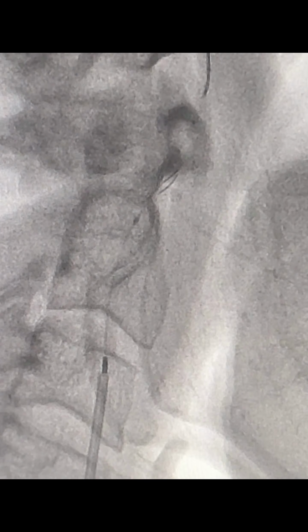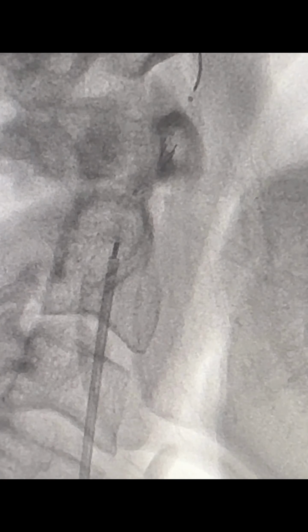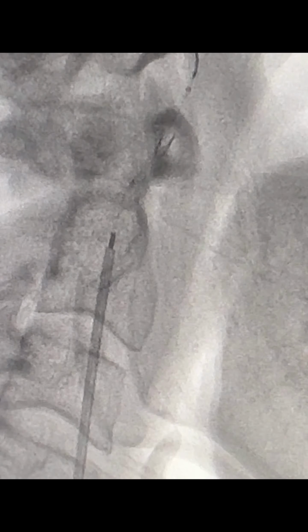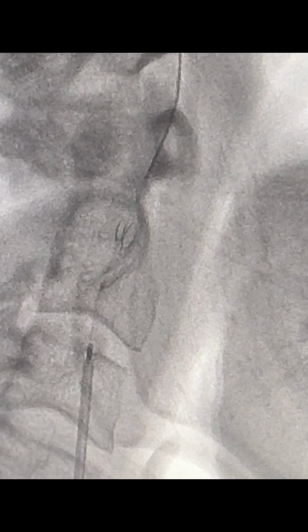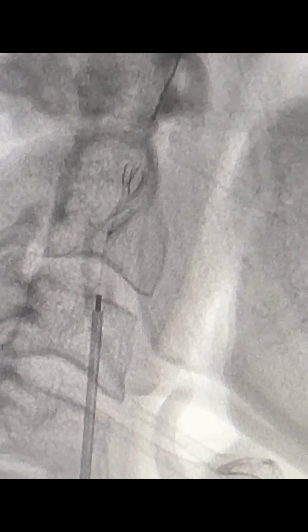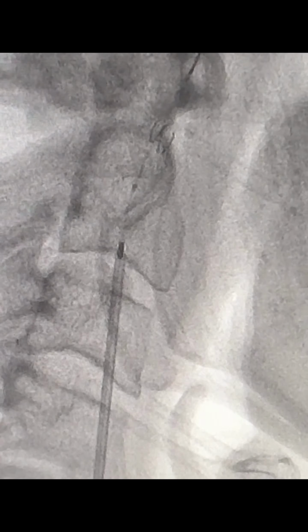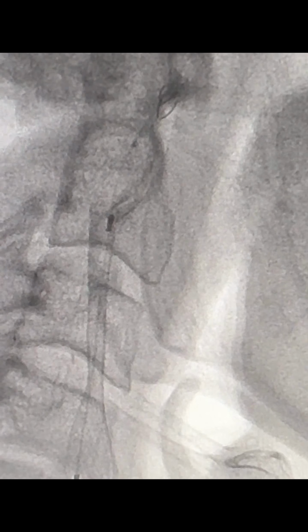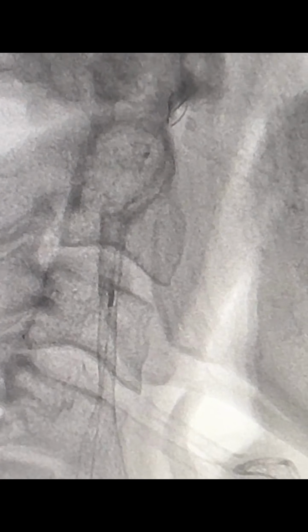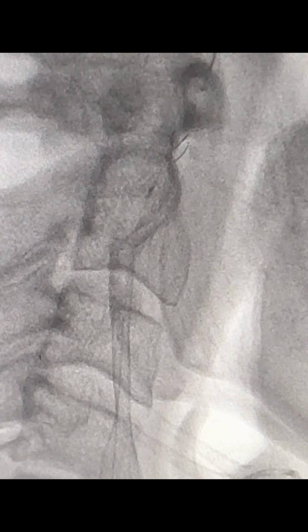So the carotid stent is being placed accurately across the narrowed stenotic right ICA stenosis. This accurate placement of the stent is confirmed by using X-rays and also using dye injection during the placement of the stent. So the stent is being deployed, and we can see it has covered the stenotic area very well, both proximally and distally. What is the next procedure?